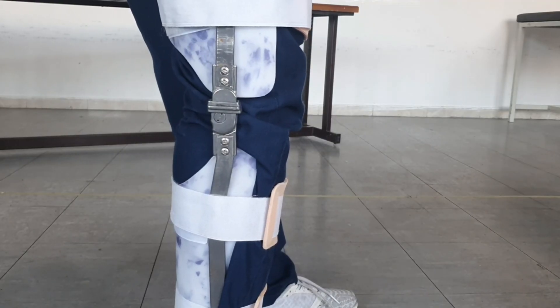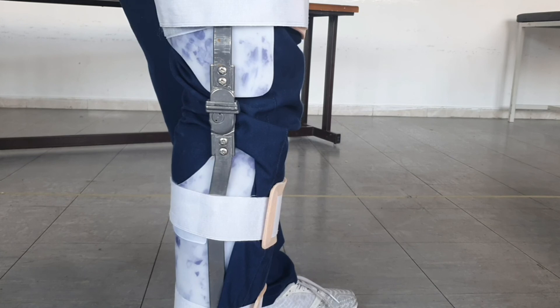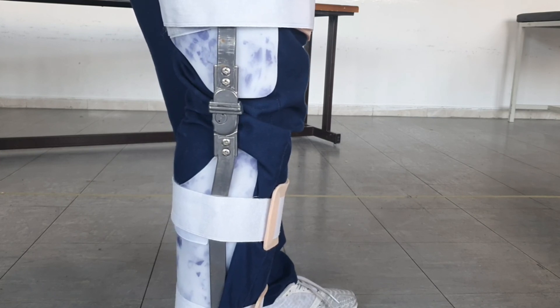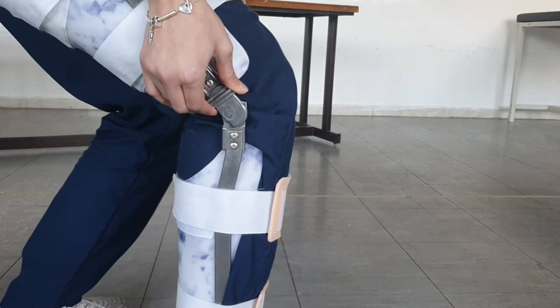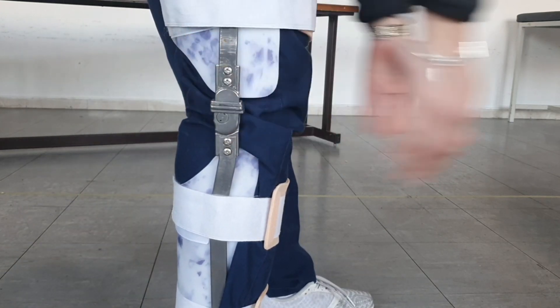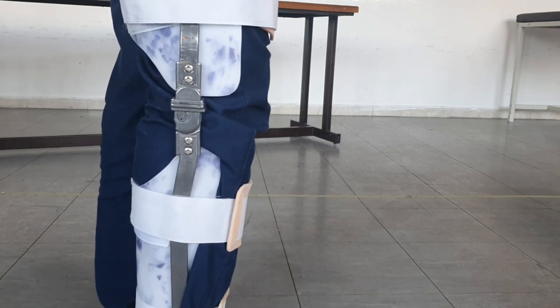Looking at the knee hinge, it should be aligned with the patient's knee — these devices are usually custom made, so here we don't have a perfect fit, but for the patient it should be. The hinge has a metal lock: if the patient wants to sit down they can release the hinge by pulling it upward, allowing them to bend their knee. When they stand up, the lock moves down and the hinge is blocked so the knee will not bend.